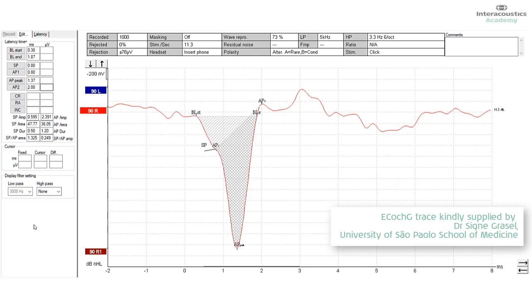Again, we put the cursor where it says AP onset and extend and then move the cursor to the point where it says AP 2. And that straight line then, and the area under that straight line will represent the area of the AP.